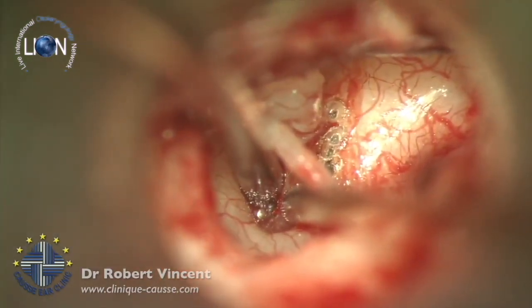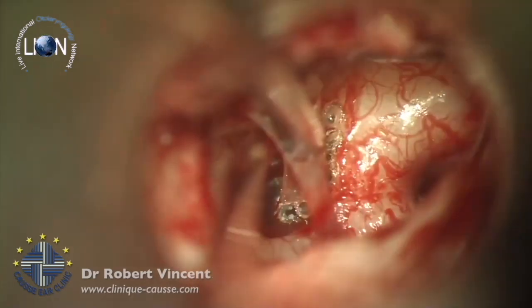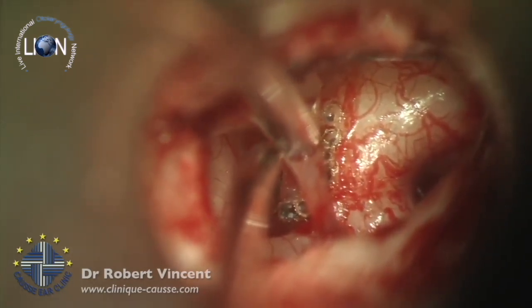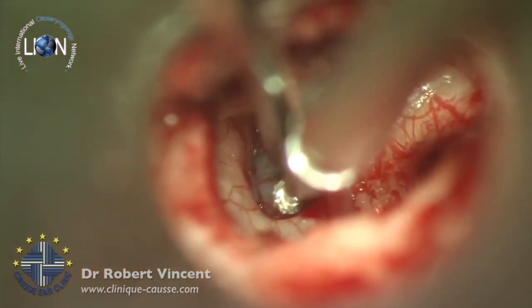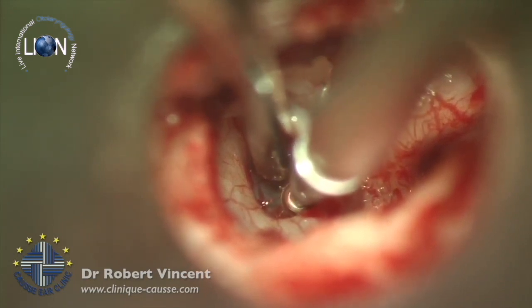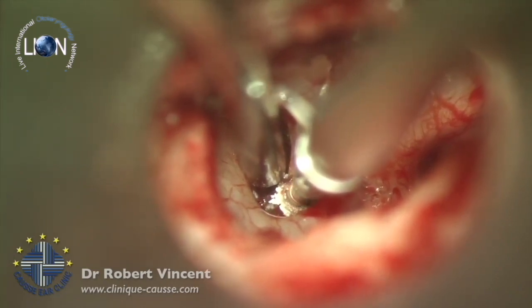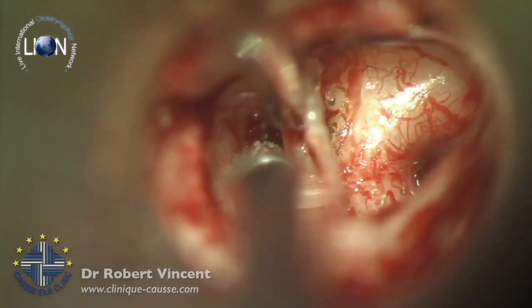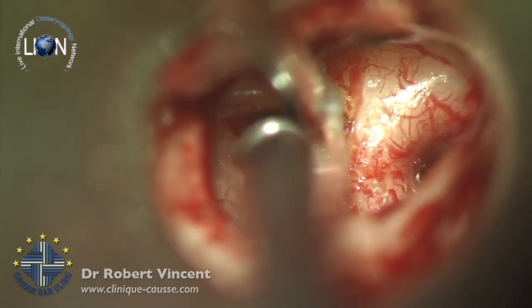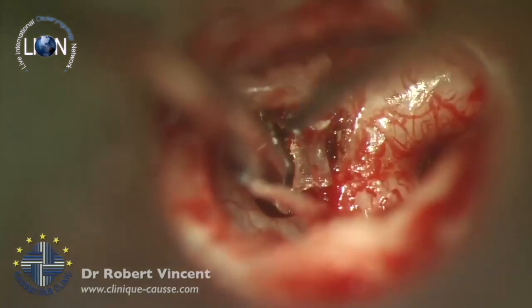And then I'm using another Lumenis CO2 AutoLase system. So I do a laser stapedotomy, which is the mixed technique of micro drill. So I'm vaporizing the posterior crus and the anterior crus. This is the AutoLase, which is a CO2 laser with handheld probe. And you see that I'm using the laser just to decrease the thickness of the superstructure. I'm not using the laser to cut completely the superstructure. This helps me to drill out the superstructure, and I'm drilling out the anterior crus. It's always trying to decrease the trauma to the ossicular chain.